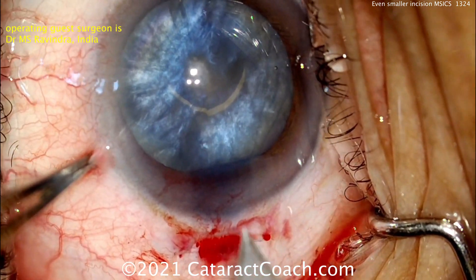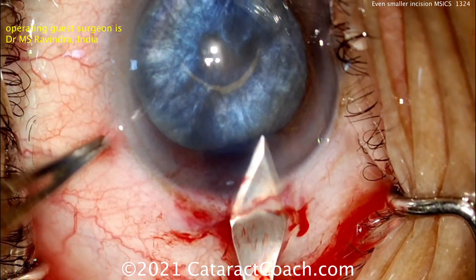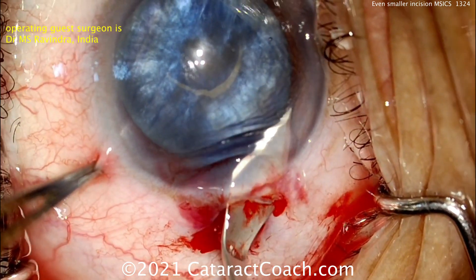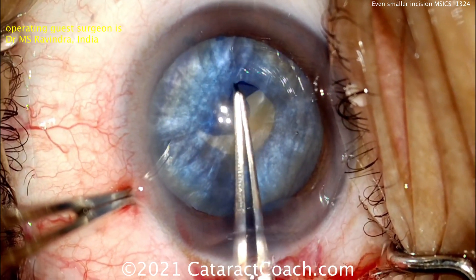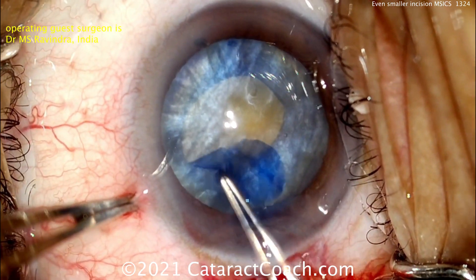Now the incision is widened up, probably to about four and a half, maybe five millimeters wide. Notice how the incision now — we're looking more into the conjunctival side and the sclera. A little bit of a mini peritomy has been done and now the incision is widened up on the inside. Perhaps the incision is about six or seven millimeters on the inside, probably about five, maybe five and a half millimeters on the outside.